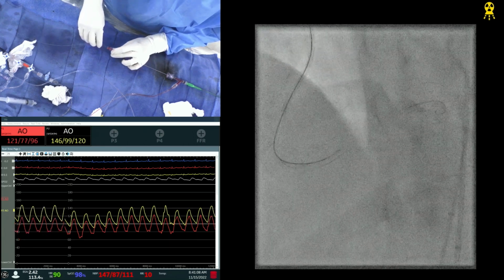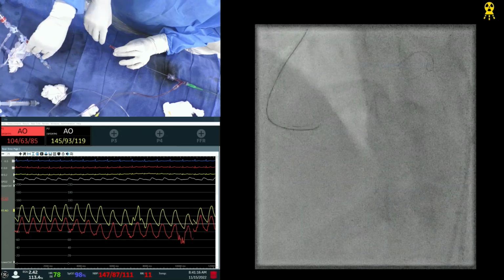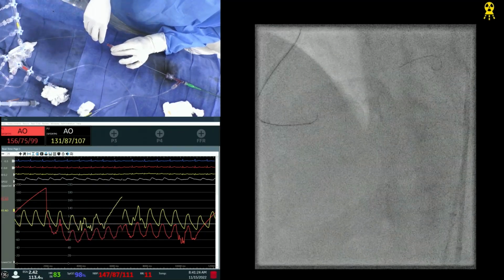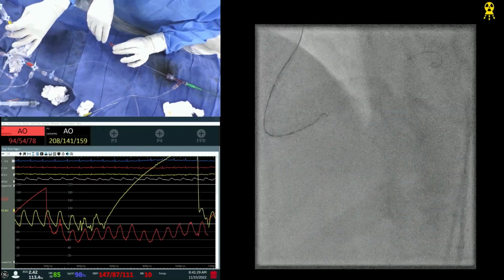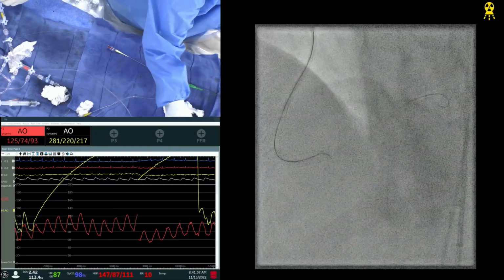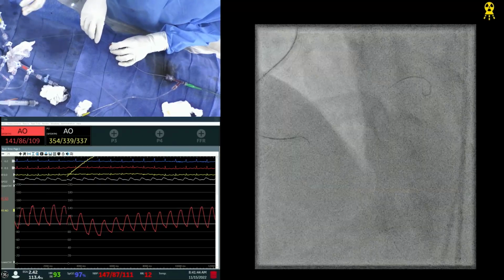And then it's not making a good turn. Actually, see better with the retrograde, yeah. Dye there, yeah. Maybe, what is going on here? Okay, yeah. Okay, now, yes.